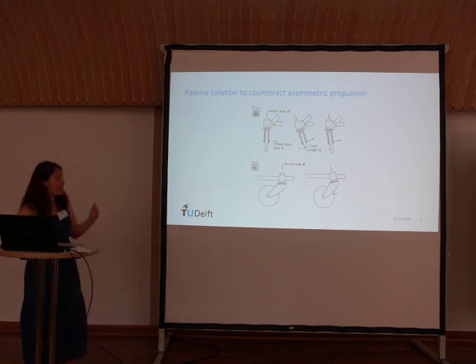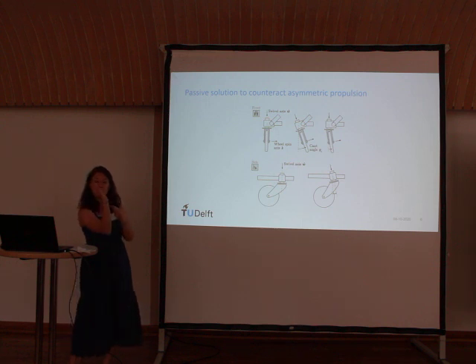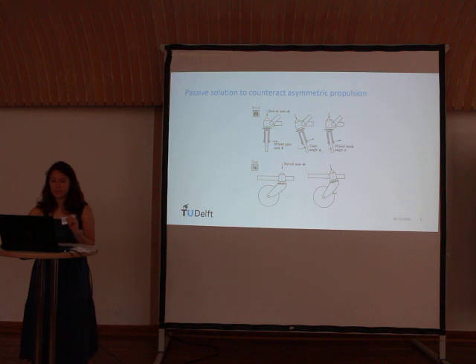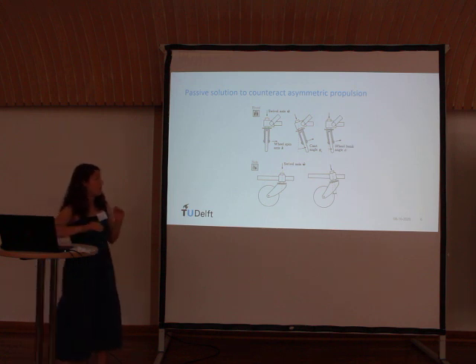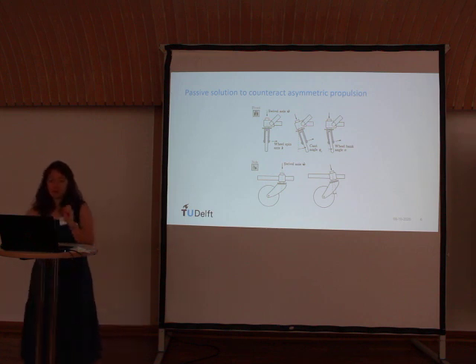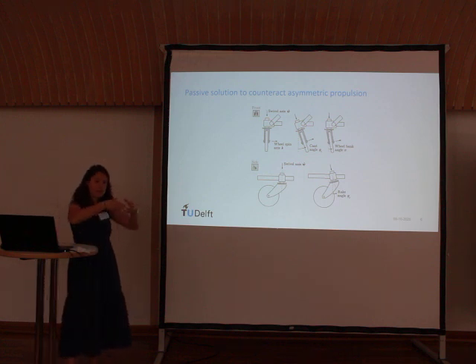The cant angle is if you take that entire caster wheel unit and then you set it at an angle in the frontal plane. And then the bank angle is if you keep the swivel axis vertical and then you just angle the wheel. There is also the rake angle, so in the sagittal plane it's if you move the wheel forwards or backwards.